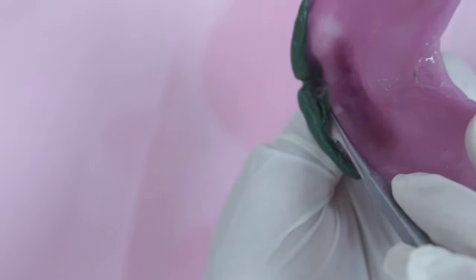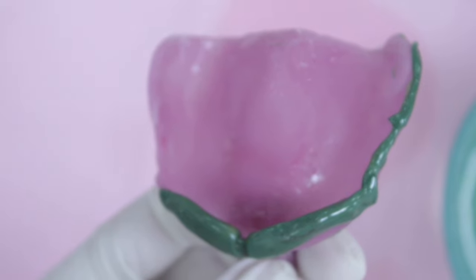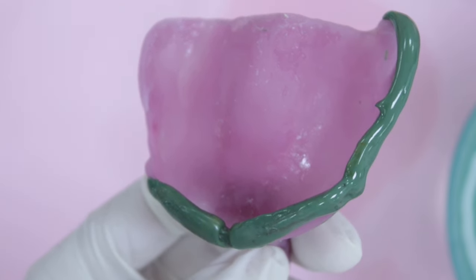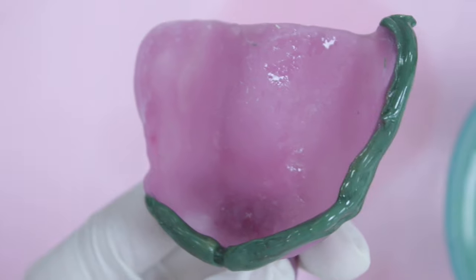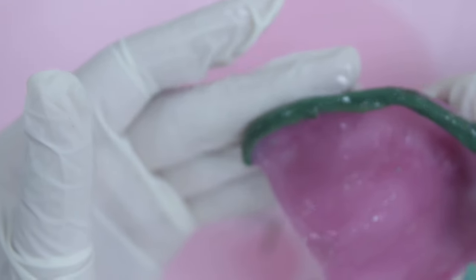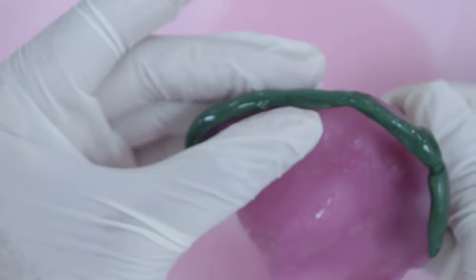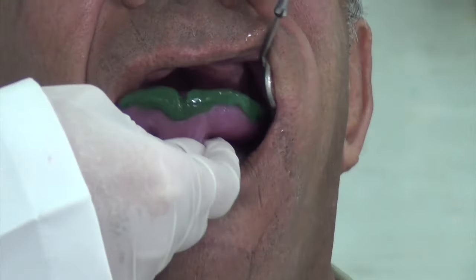Trim the excess material from the inner borders of the tray, then heat the periphery to border mold the distobuccal vestibule on the right-hand side. It is important to apply adequate thickness of compound material on the tray borders to record the full width and depth of the vestibule. Use a small amount of Vaseline on your fingertips to manipulate the impression compound, pushing it about two to three millimeters beyond the borders of the tray. Then heat it on the Bunsen burner and temper it before introducing it again to the patient's mouth.